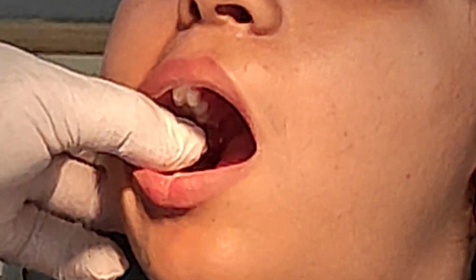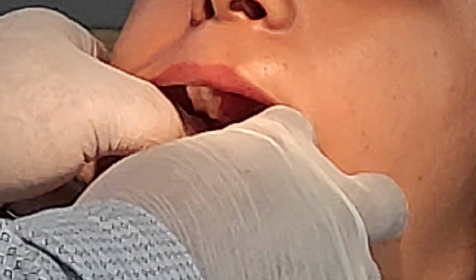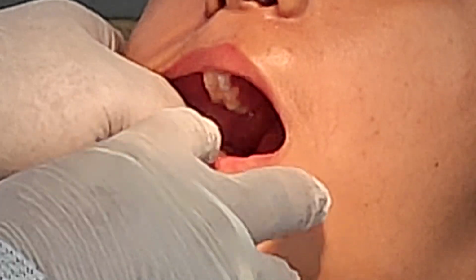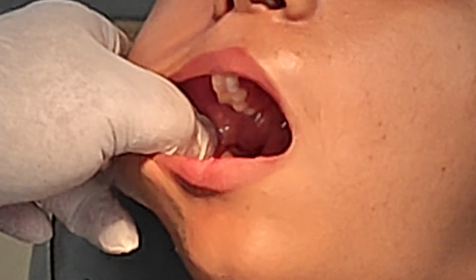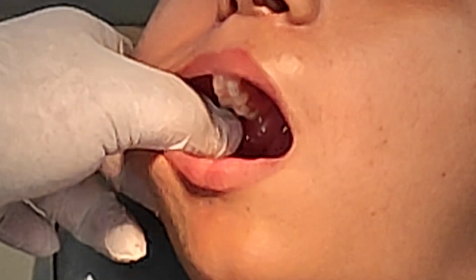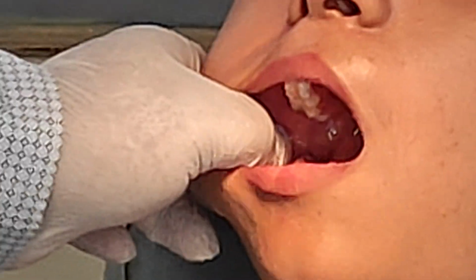So, for the inferior alveolar nerve block and the lingual nerve block, we have to identify some landmarks properly so that we can give a proper technique. The landmarks are the coronoid notch, pterygomandibular raphe, the occlusal plane of the mandible, as well as the lingula. Fine. So, how to go about it?